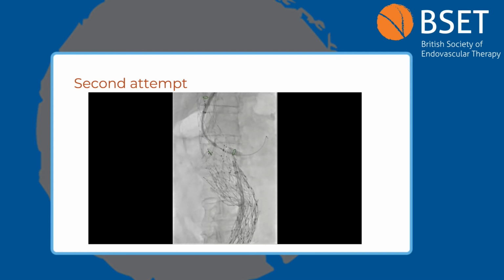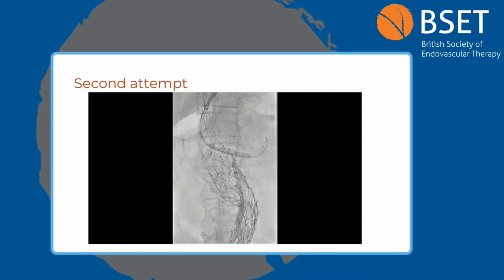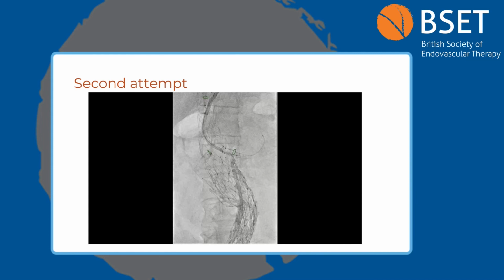I think we still have a completion angio, but it's really extreme tortuosity and extreme misalignment of that fenestration. And there are several things we can discuss. I think branches would have been the right choice for this case, particularly the left. I wish I had done a branch, but it's one of those that for some reason I decided to do a fenestration and had to live with that regret.